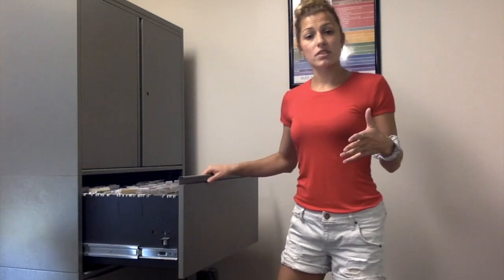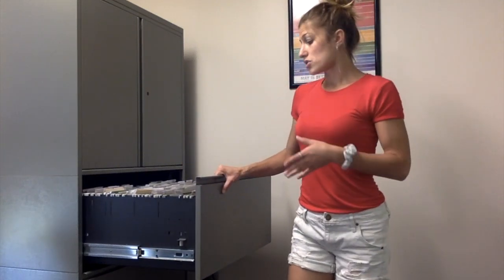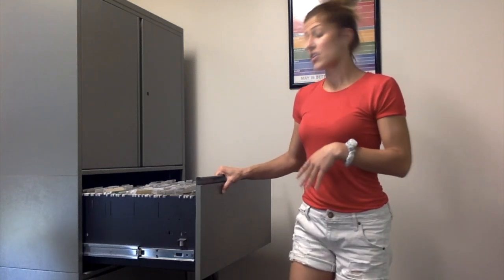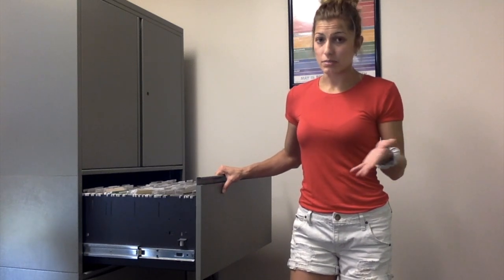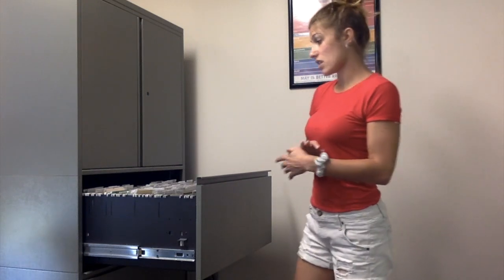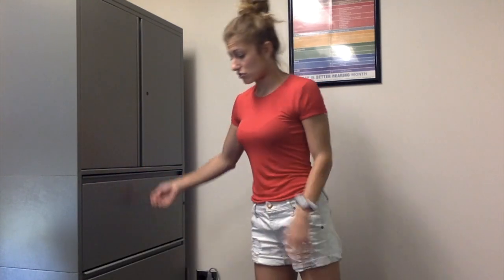In the first drawer, you'll find all of our screening forms that you should prepare prior to your screening depending on your client. There are case histories for children and adults, as well as a hearing handicap inventory for adults and the elderly, and a preschool or school-age sifter that you might need depending on the child, as well as your screening form, which is essential. You can also find informational forms helpful to the family or adult client, and screening forms appropriate if you're performing an APD screener.